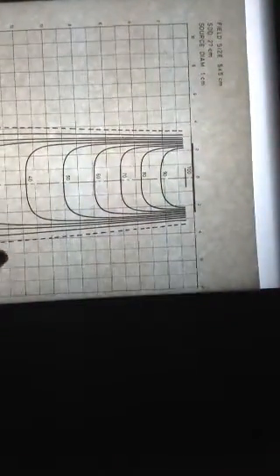Okay, the second demonstration is going to be for the second assignment, where you have to put two beams onto the contour that I gave you. So we use the same contour we use for the shift technique, this one. And I have my contour here, and I'm going to decide again where I want my beams to intersect. I'm going to call that the central axis. That's where we're going to put the isocenter. I've identified it just by putting a dot there and then extending the lines there, making an X. So whatever beams I put on need to go through this X.